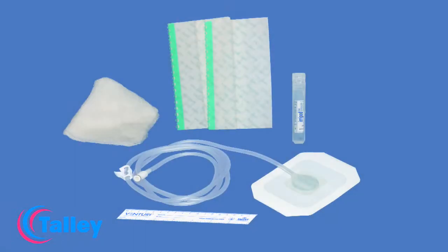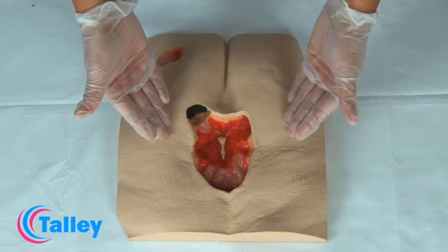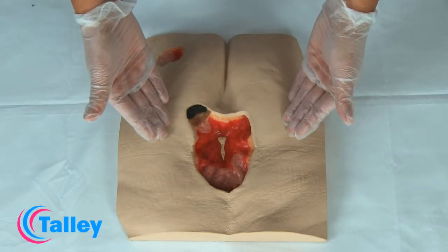This is a product demonstration of the Talley-Venturi portal drain and GORE's wound care set application technique, using a model of a grade 4 pressure ulcer with exposed bone.